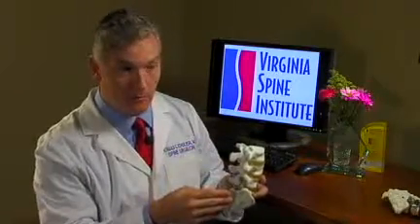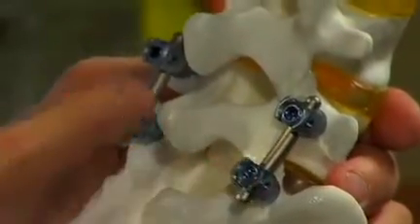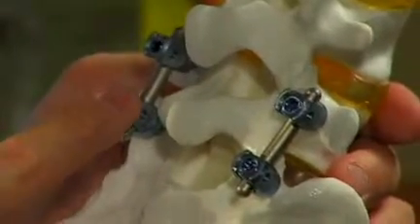In the old days, they used to fuse multiple levels and had a hard time getting them to heal. But with the modern instrumentation, we can actually lock into one or two levels and get precise healing of just those areas and not disrupt the rest of the motion of the spine.